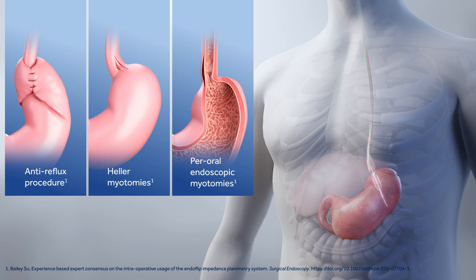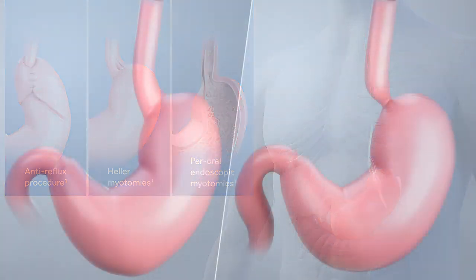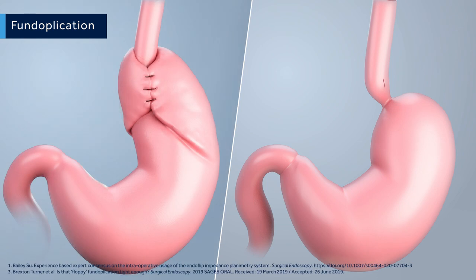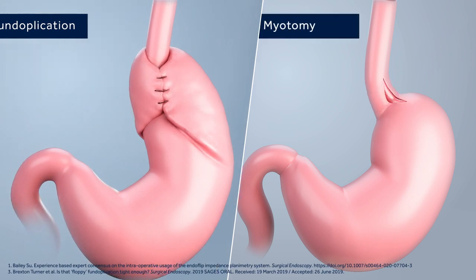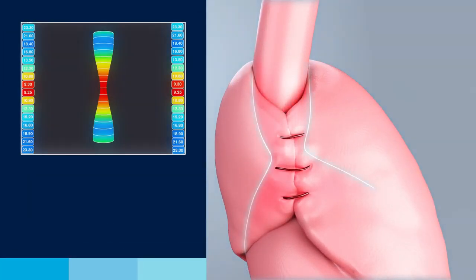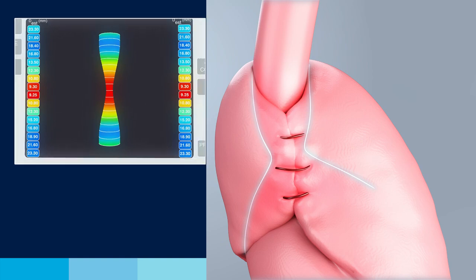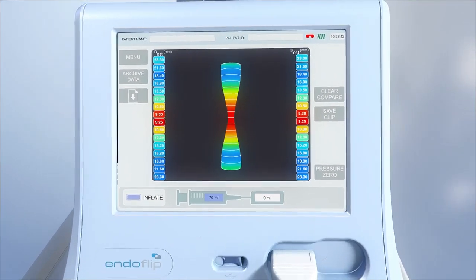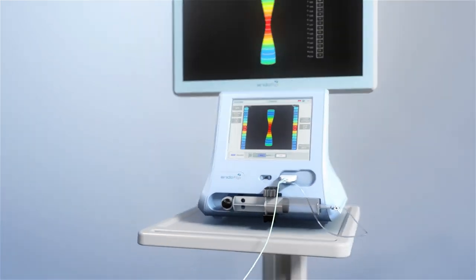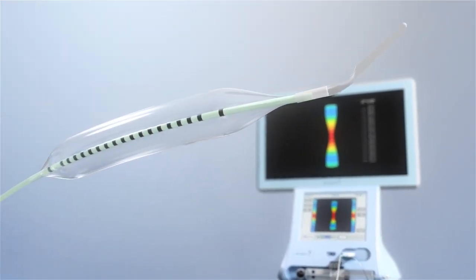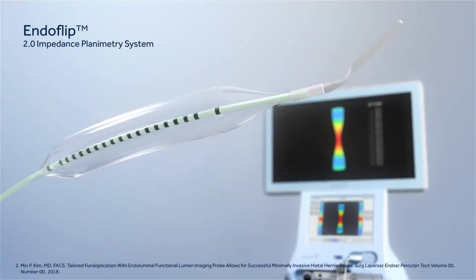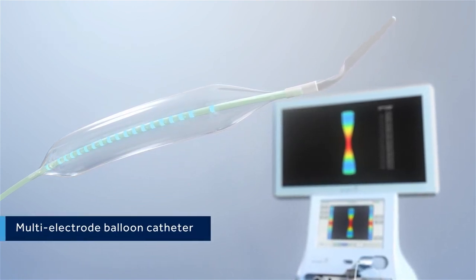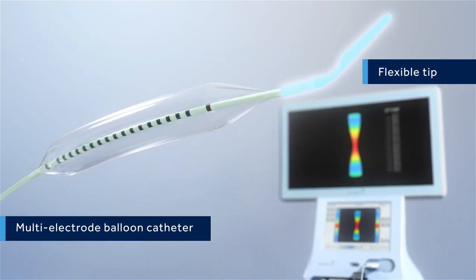During an operation, the tightness of a fundoplication or adequacy of a myotomy needs to be carefully assessed. The EndoFLIP impedance planimetry system provides an objective way to determine the tightness of the repair and displays the data visually. EndoFLIP 2.0 includes a multi-electrode balloon catheter with a flexible tip that acts as a functional lumen imaging probe.